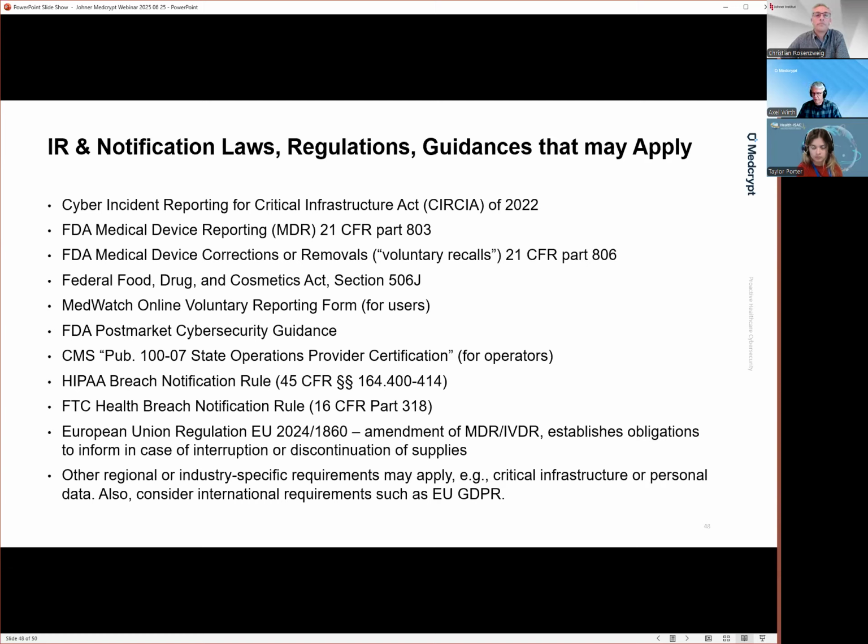If you use one type of SBOM tool to identify your vulnerabilities, there is no need to use a different tool post-market, for example. But there are some differences in the overall concept. For example, in pre-market vulnerability management, you're dealing with a much higher volume. You have many software components you're looking at for the first time, and you uncover all the vulnerabilities you didn't know of, and you need to address all of them.